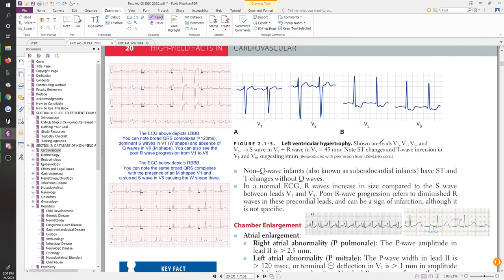So although they've put that knowledge here, don't let that intimidate you and make you feel like, oh my god, I can't do this. Just take it for what it is and keep it at that. It's not really a knowledge base that I would say is critical to know. The more obvious thing to actually catch here is the fact that the lines are not coming back to baseline. Right? That's what you should really start seeing here.